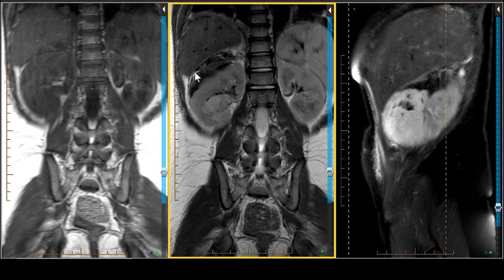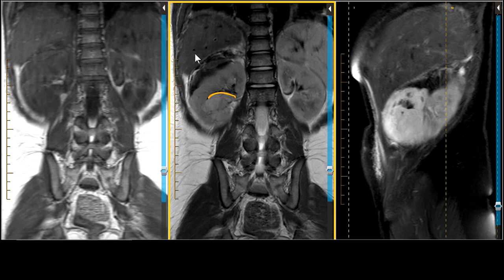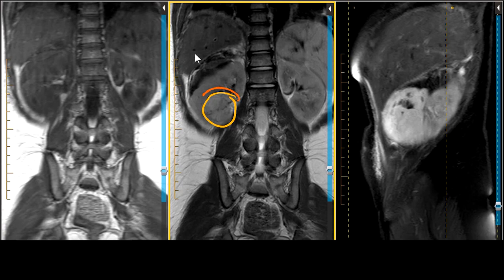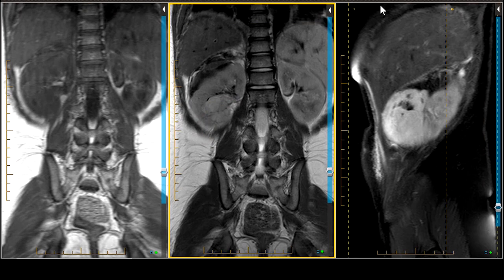When looking at a mass arising from the kidney, the claw sign is helpful. You have a mass here, and the kidney is seen as a claw wrapping around the mass — and we do have that here. There's our claw, which also favors this as a primary renal mass. Note that Wilms tumor can rarely arise in extrarenal sites, so identifying the site of origin is fundamental to building an appropriate differential diagnosis.